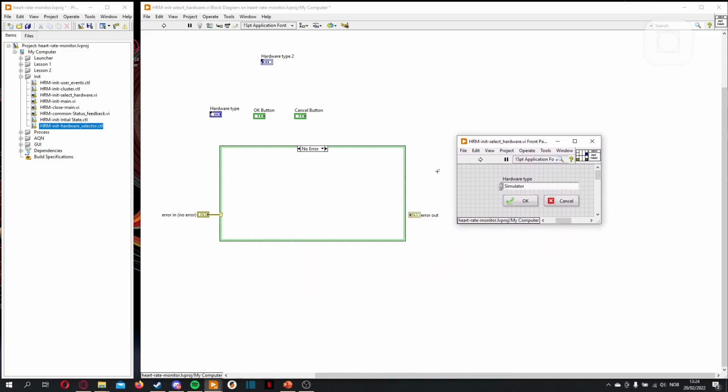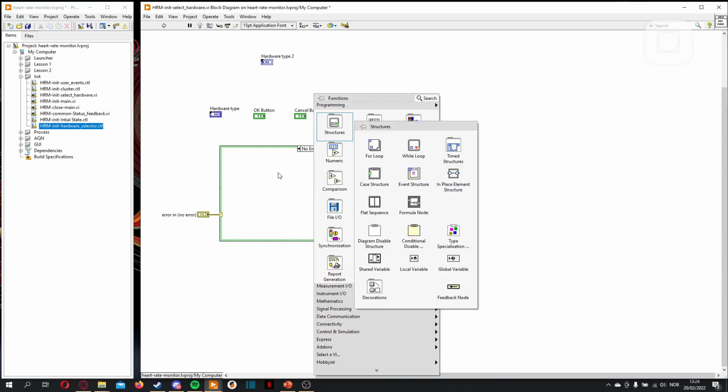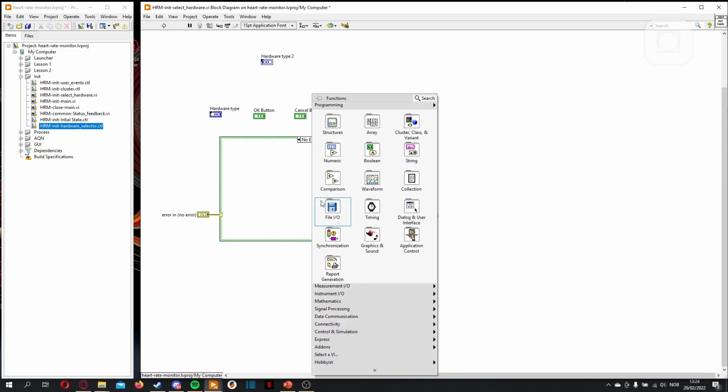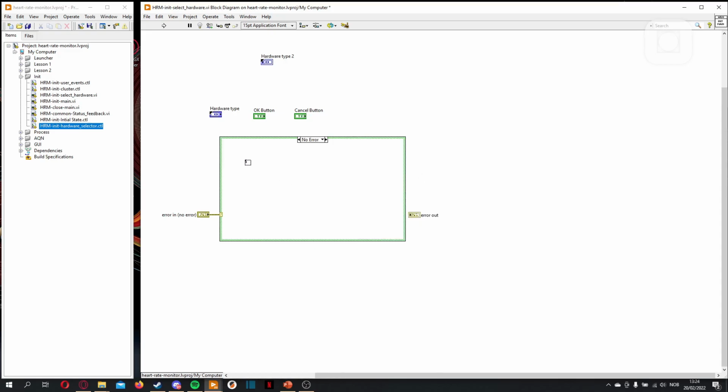So when we make the backend, there's multiple ways to do it. One could just have a while loop that just checks when you press it, but I always prefer using a user event. And this is because it uses less power, because it just waits. It just waits for you to make the choice. It doesn't need to have a wait, so you don't have to unnecessarily wait when you want it to proceed. And it doesn't use unnecessary CPU, because it doesn't need to check all the time if something has happened.